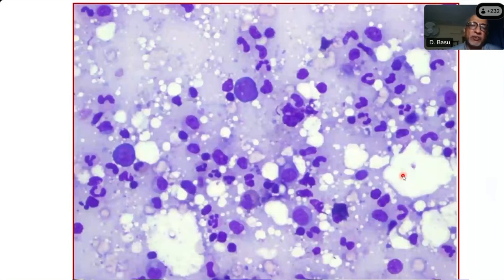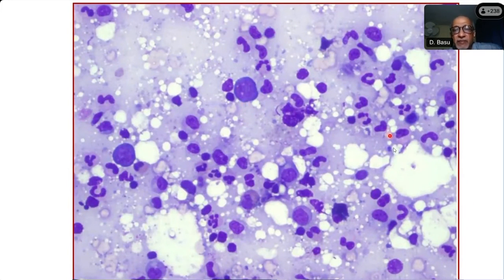Right. So what did you see in the slide that was given to you? In this slide, we can see hematopoietic cells. A few erythroid precursor cells can be seen here. Ritu, can you tell us which specific hematopoietic cells you have seen? Pro-erythroblast. I'm circling these. These are the erythroid cells, right? Erythroid, yes, sir. Okay. What about the rest of the field?